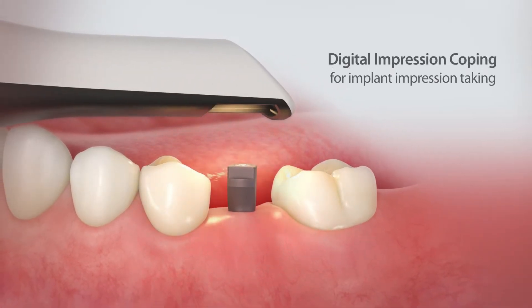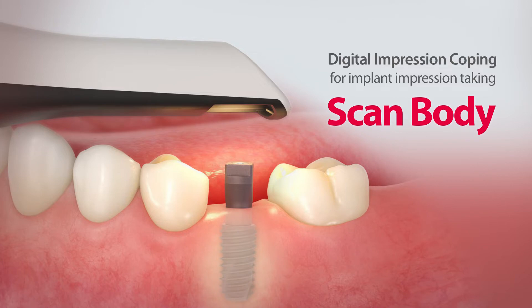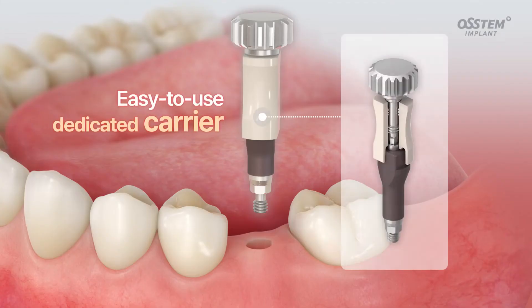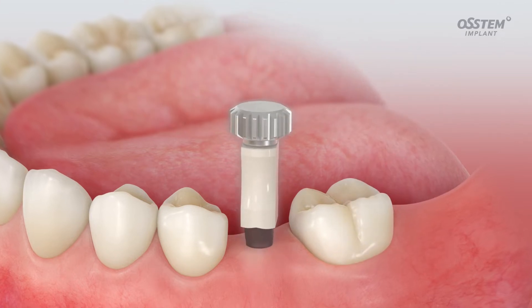Introducing ScanBody. The ScanBody is a simple and easy way to take digital impressions of implants. Thanks to the dedicated carrier, the ScanBody helps you assemble implants more accurately and conveniently.